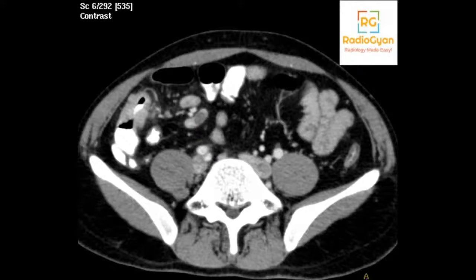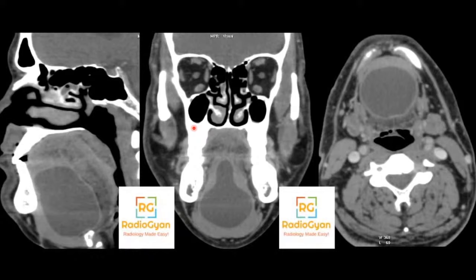Moving on to the next case. So this is again a typical spotter, and we'll wait for some more time. Okay, everybody got it right. So this is a ranula. Epidermoid, as someone mentioned, is a differential, but this is a typical case of ranula.